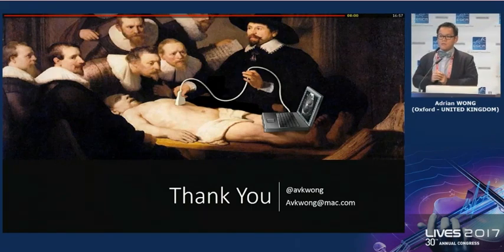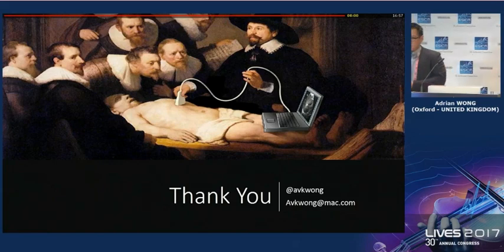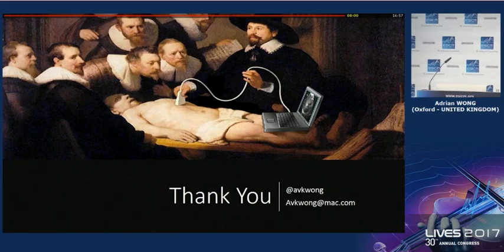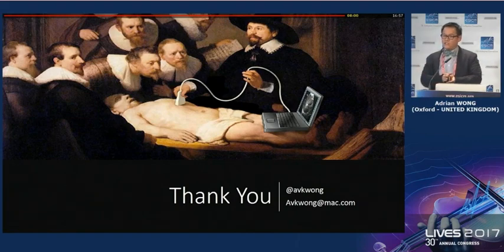Right. Thank you. Yes, please, another question. Thank you very much for your nice presentation. But don't you think, and you agree with me, that one of the big advantages of using ultrasound in management of respiratory failure patients is to differentiate between cardiogenic and non-cardiogenic pulmonary edema? So the question is trying to differentiate between cardiogenic and non-cardiogenic pulmonary edema, if I've understood your question correctly.